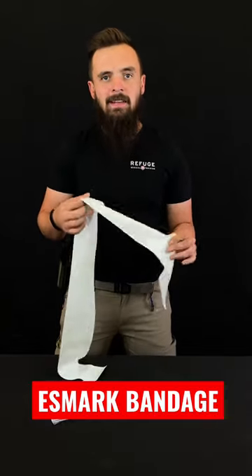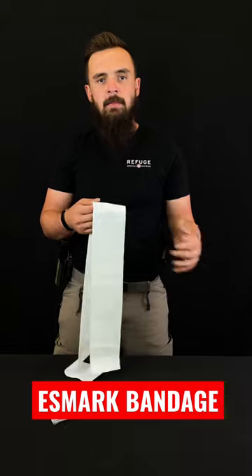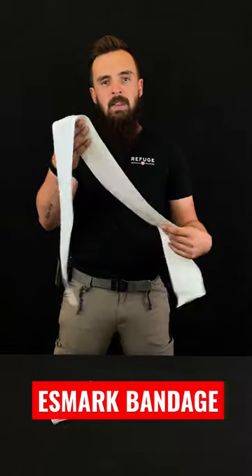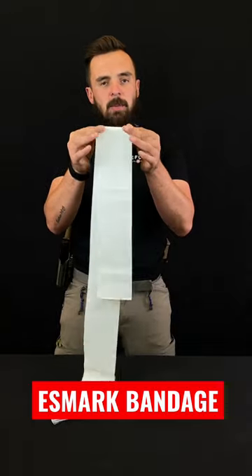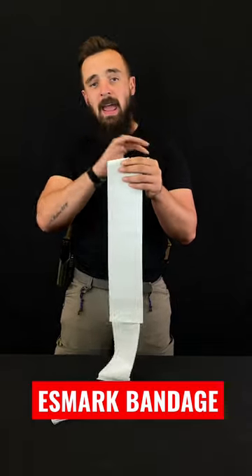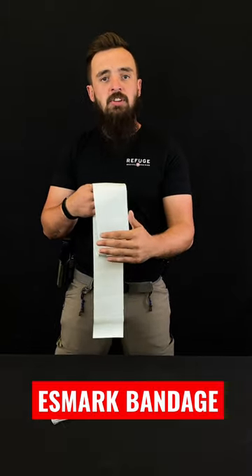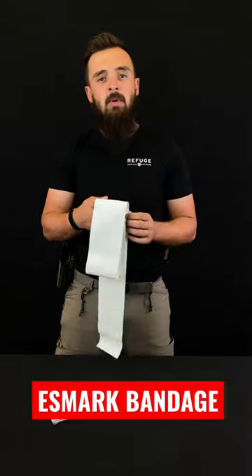Something we're constantly asked is, what if my child has a small limb and a soft tee or a cat gen 7 won't work? Well, that's where the Esmark comes in play. At the perfect width of a little bit over two inches, it helps prevent any nerve damage and at the same time will give you the proper arterial restriction to stop the bleeding with anyone with a small limb.